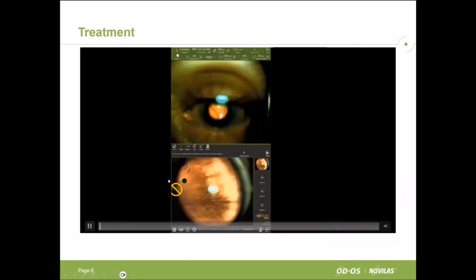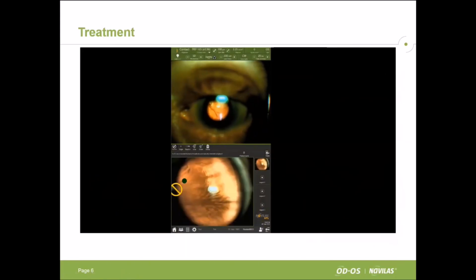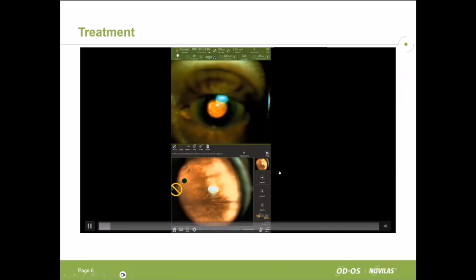Another useful advice would be to proactively turn on the color illumination while you plan your treatment and ask the patient to look at it, just so that the patient can adapt to the bright flashes of the laser which will happen during the treatment.